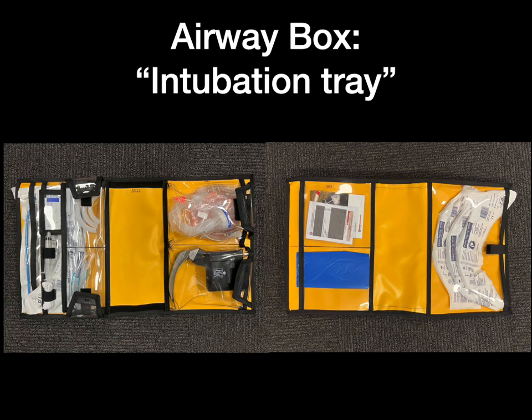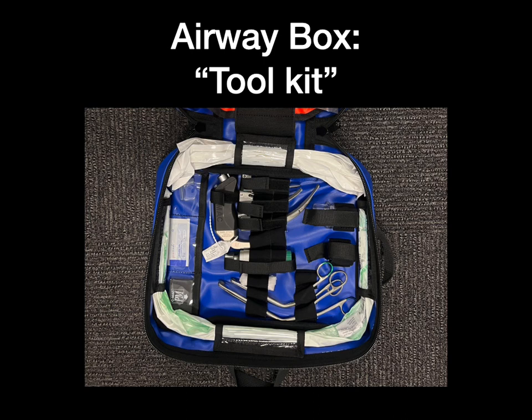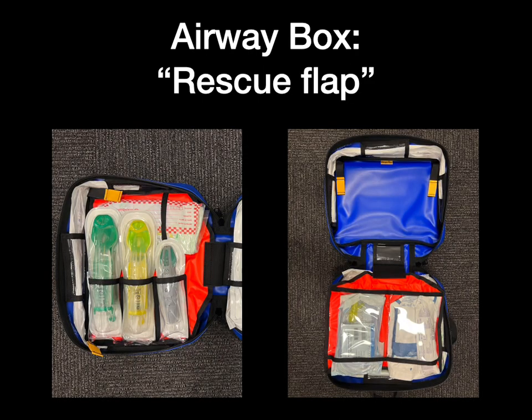Underneath the intubation tray, on one side is the blue toolkit. This contains an assortment of bougies, stylets, Magill's forceps, different laryngoscope blades, and other adjuncts that may be required for a non-standard intubation. On the other side, in high-vis orange, is the rescue flap to rescue a failed laryngoscopy attempt.